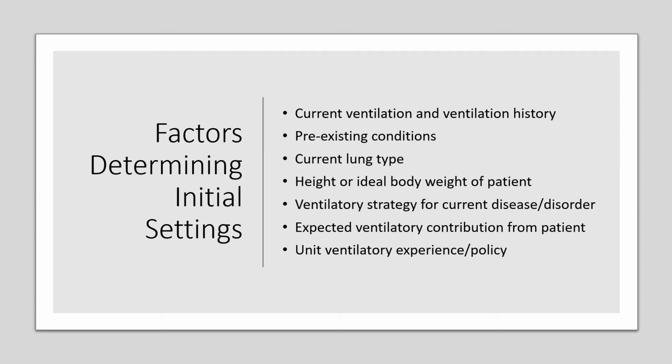Then the other thing that sometimes we forget is, what do we expect from the patient? So are we expecting the patient to contribute? So normally on admission, usually not, but that could change rapidly. So is this a child we're trying to wake up quickly? And if so, therefore we wouldn't go to a control mode, which you could theoretically use, because you're going to want him to wake up, and when he wakes up he can just go straight into his synchronous mode.